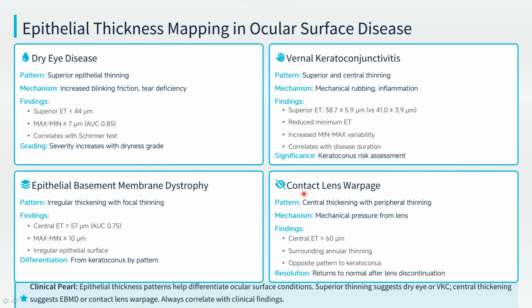For example, for people with dry eye, most of the studies show that there will be significant thinning of the corneal epithelium as compared to the normal, and this could be due to increased and accelerated death of the corneal epithelium, delay in the turnover, and affection of the limbal stem cells. So these people will have a decrease in the corneal epithelial thickness.